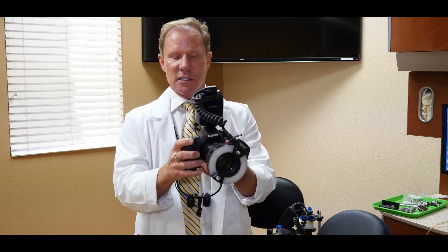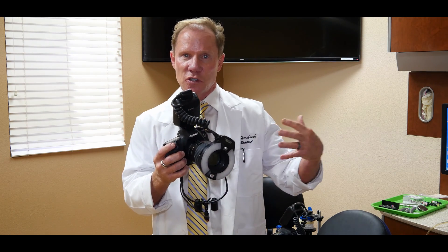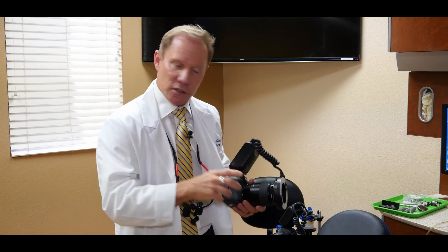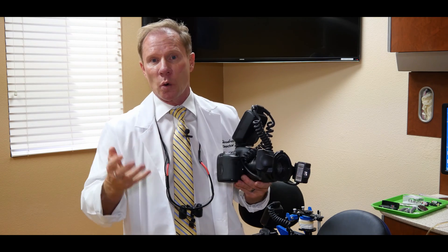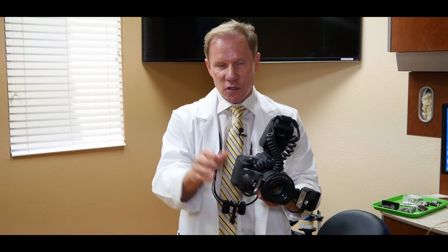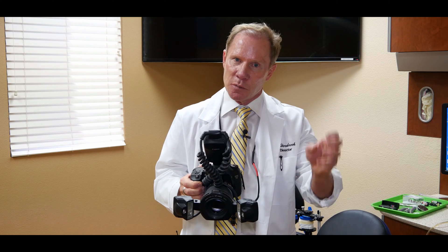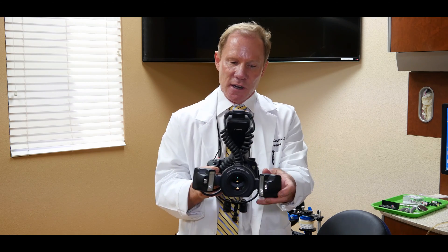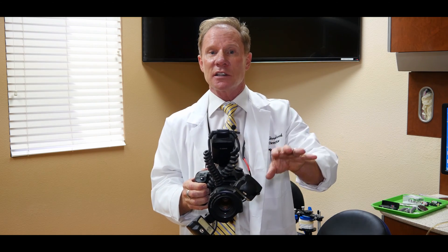The nice thing about a ring flash is when we shoot, we get even flash distribution around our subject. The second option is the double point flash. A lot of ceramists like to use these because they can move the individual flashes to create shadowing and more of a three-dimensional effect. The problem is with clinical photography, if we want the exact same image from before to after, if we happen to bump one or it's in a different spot, that after shot will not look exactly like the before.